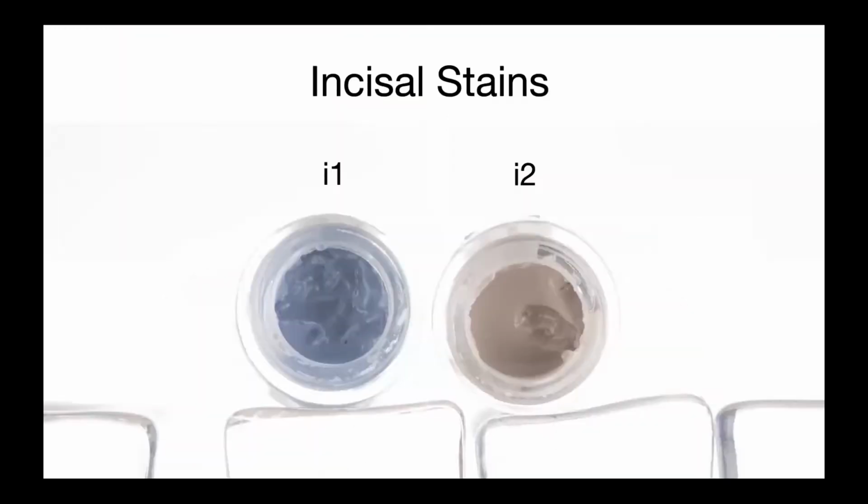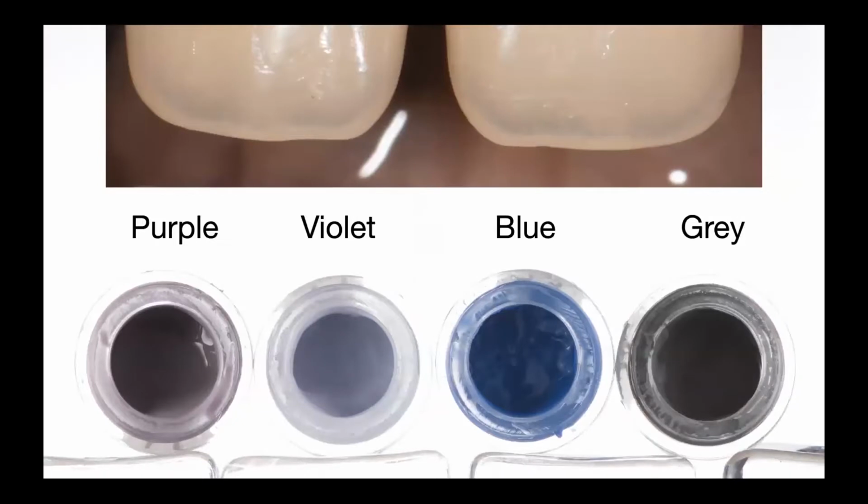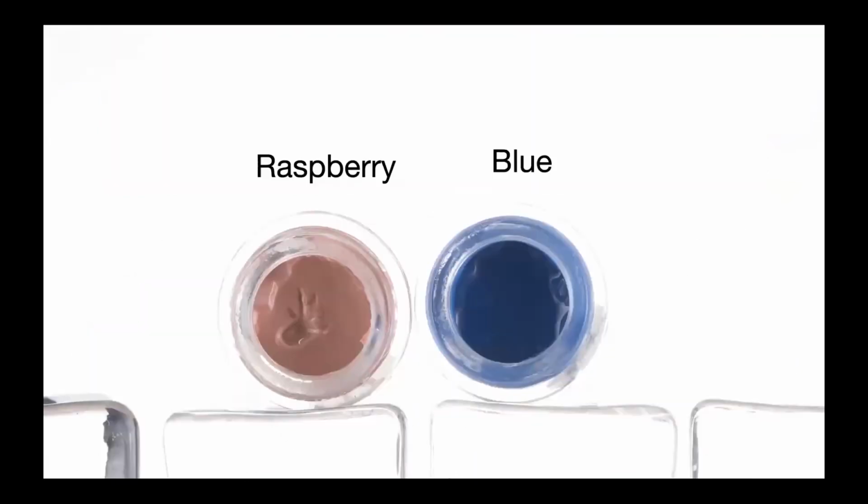Every system of stains includes incisal stains, and our monolithic restoration can be customized in enamel areas with the help of these stains, or shades like purple, violet, blue, and gray to emphasize the enamel edge, for example. But I'd like you to pay attention to the next two components, red and blue, because when we mix them together we can get the complicated violet shade.